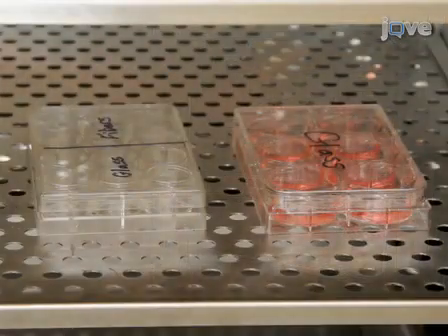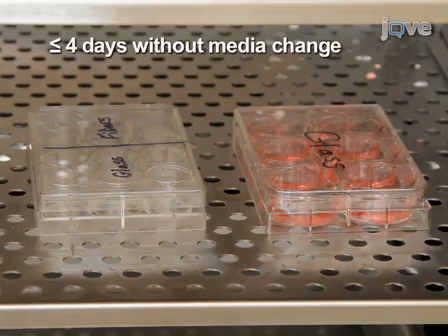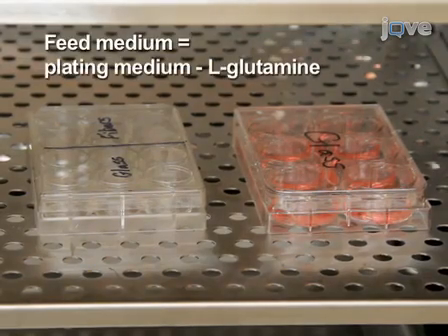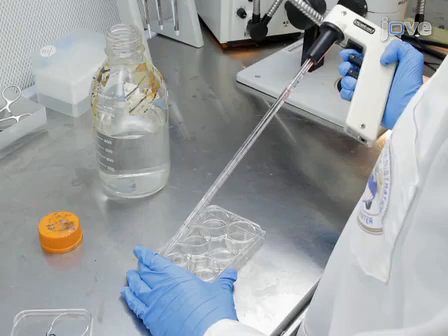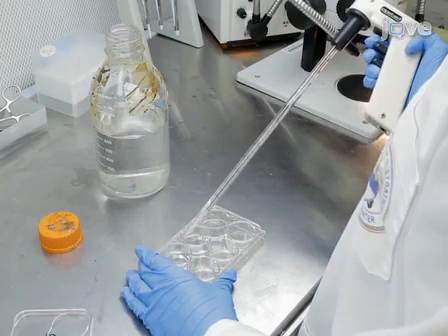Cultures can be maintained for up to 4 days without media change. For longer cultures, half media changes should be done with feed media. Feed medium is the same composition as plating medium, minus the L-glutamine. Once the cells have reached the desired time point, immunocytochemistry can be performed according to the instructions in the accompanying written protocol.